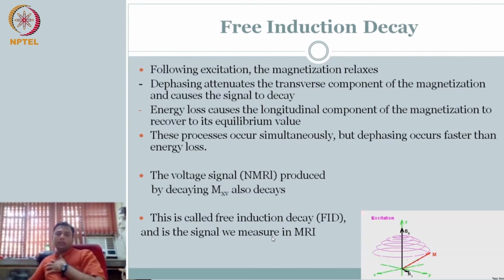Okay. Now the question is, we saw something as T2 star. What does that T2 star mean? Notice how the signal can lose its magnitude. Dephasing, right? When it is dephasing, that means there is a subtle difference between the frequencies of the neighboring nuclei. We talked about spin-spin, that the neighboring nuclei can affect the spin-spin interaction, causing some to spin faster, some to spin slower, slightly around plus or minus the omega frequency that you have, the Larmor frequency.